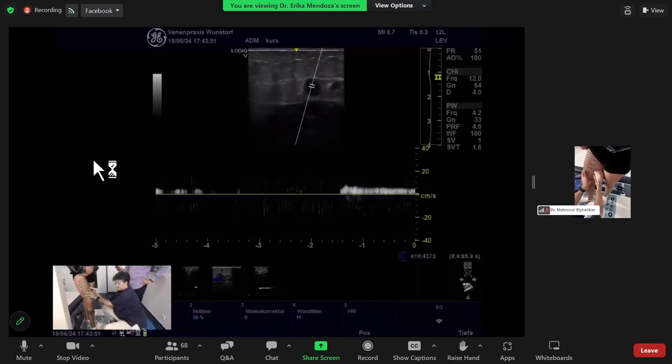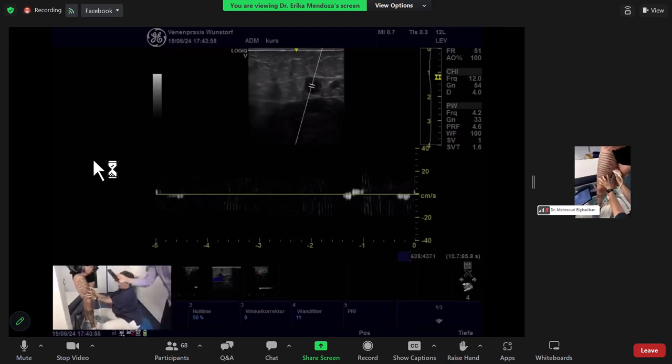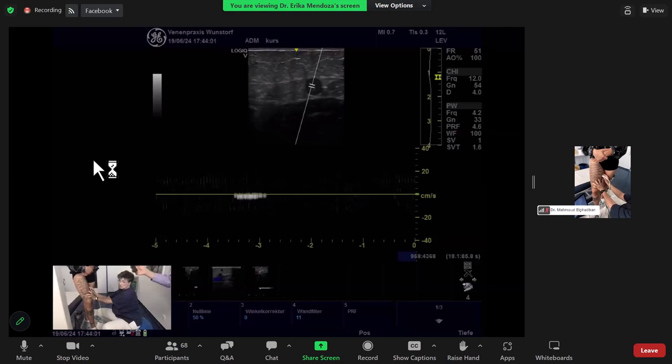If you see the finger here, Mahmoud, your turn. Yes, I close the tributary with my finger. I can see your finger closing the tributary. Lower the toe. There is no longer a reflux. Excellent. So you know the source of the reflux.